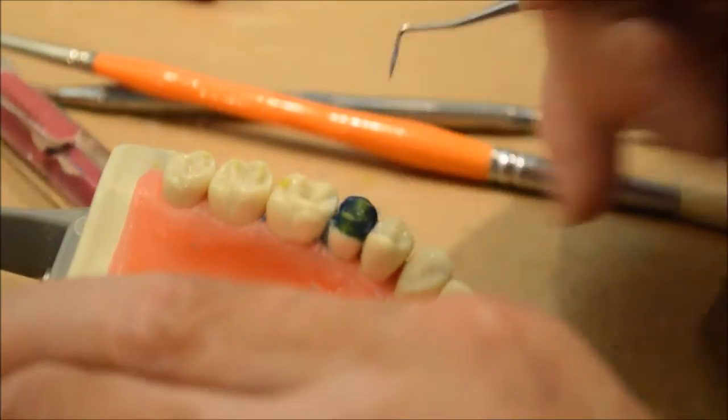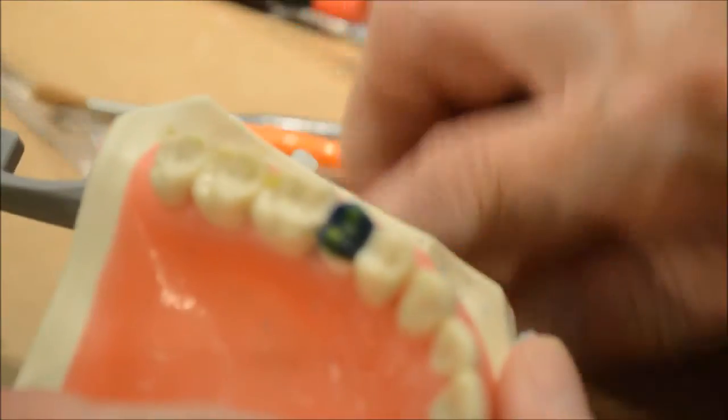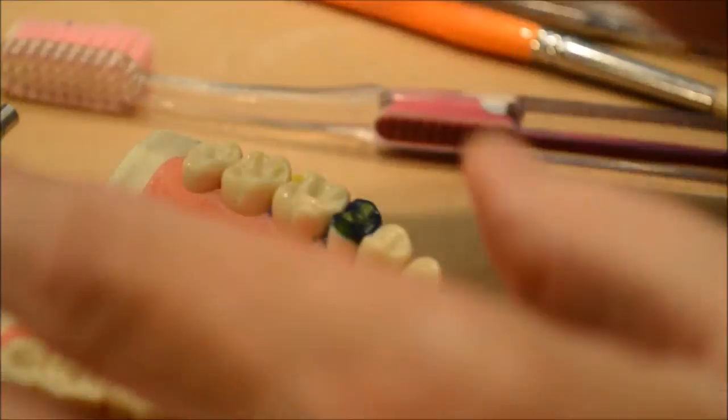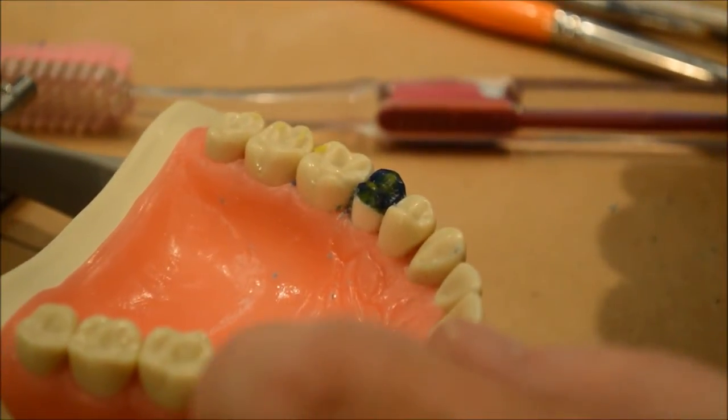Basically we've got the outline of the crown already done, so we basically have it just like this one over here.